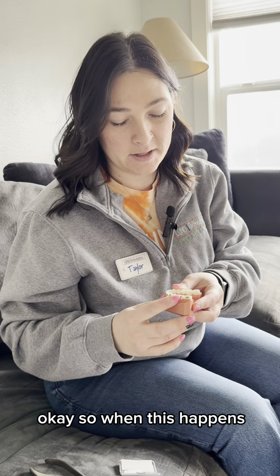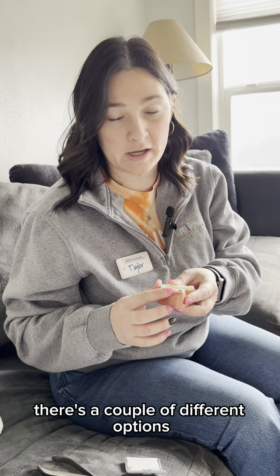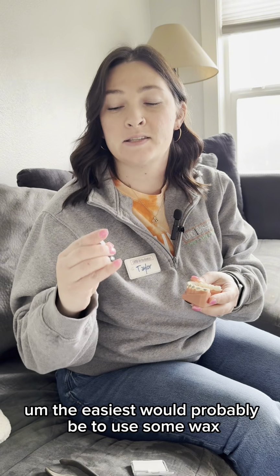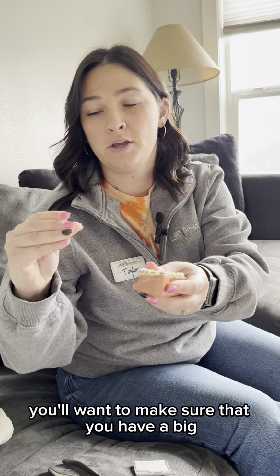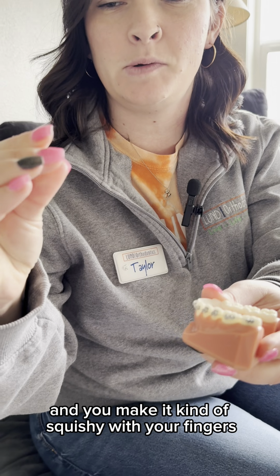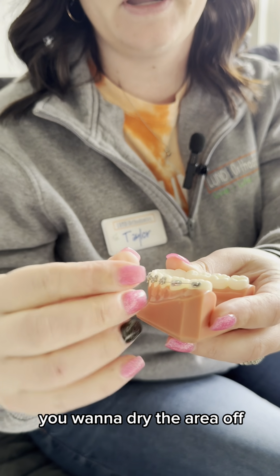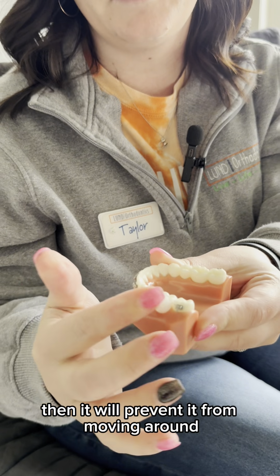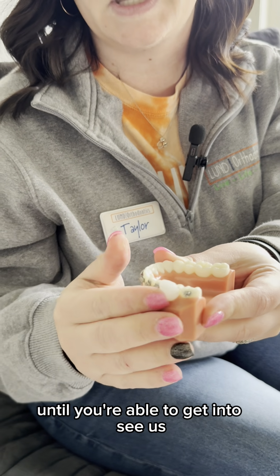Okay, so when this happens, what can you do at home to fix this? There's a couple of different options. The easiest would probably be to use some wax. You'll want to make sure that you have a big sized ball of wax and you make it kind of squishy with your fingers. You'll want to dry the area off and you can squish it onto that bracket. Then it will prevent it from moving around until you're able to get in to see us.